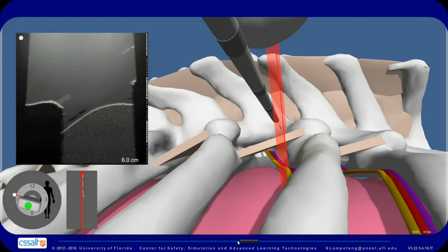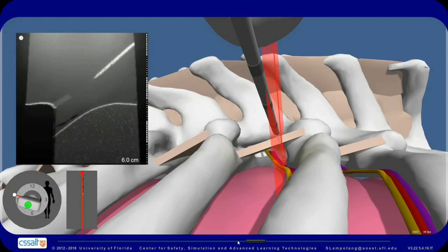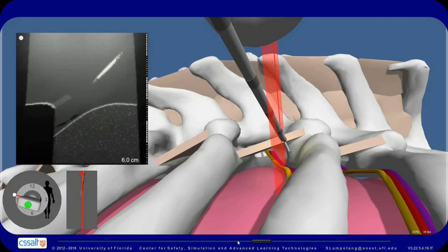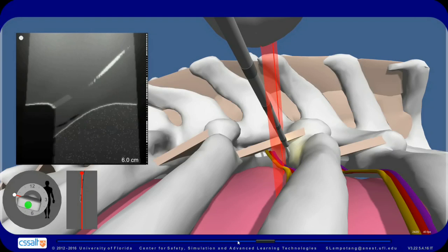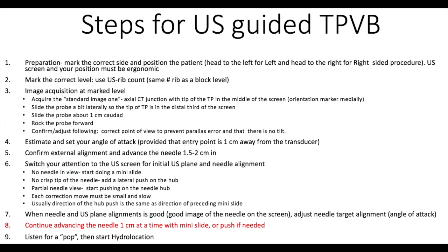In this example, after visualizing the needle and adjusting the angle of attack, we advance the needle 1.5 cm toward the TPVS. But during this advancement, we lose the view of the needle tip on the screen. After losing sight of the needle tip, stop advancement and apply a gentle lateral push on the needle hub. Continue advancing the needle 1 cm at a time with mini slide or push if needed.